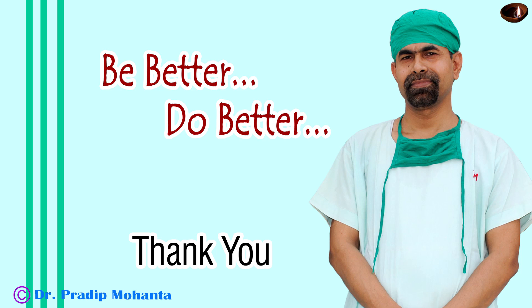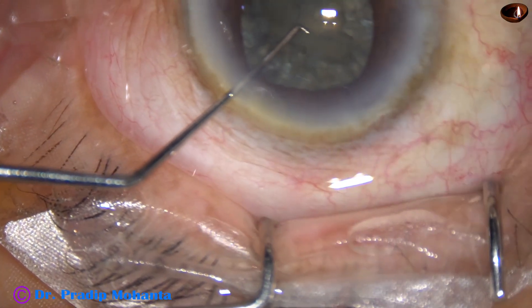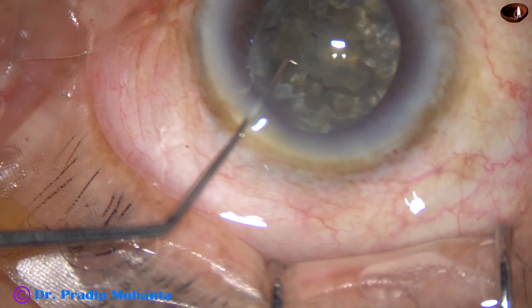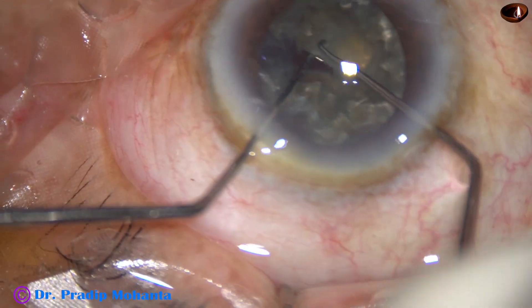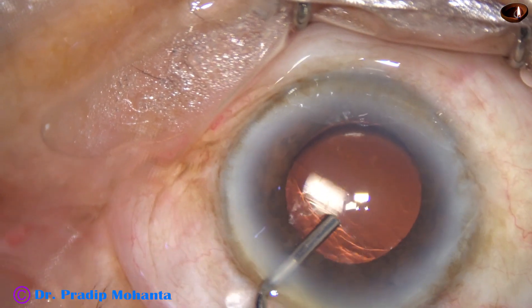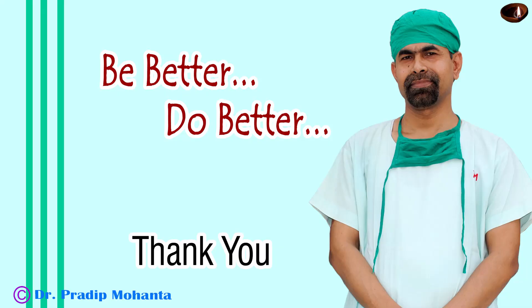You can see that the anterior capsular rim is nicely overlapping the intraocular lens. Thank you very much for your attention. I hope this video will help you in developing your surgical skills. The key points in this video: if you find there is incarceration of iris at the side port, don't remove the chopper — if you do you will cause iris injury. One more thing: if there is a small nuclear bit, always try to remove it at the earliest opportunity. You can use some visco, depress the posterior lip, and remove it. Be a great surgeon and serve your patients with love, respect, empathy, and great surgical competence.